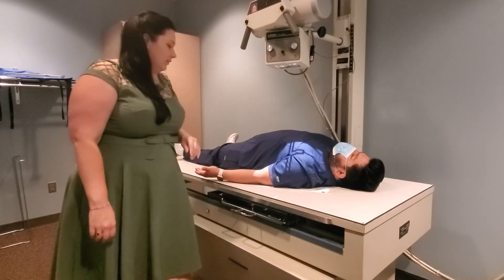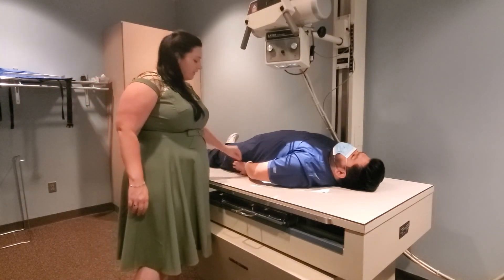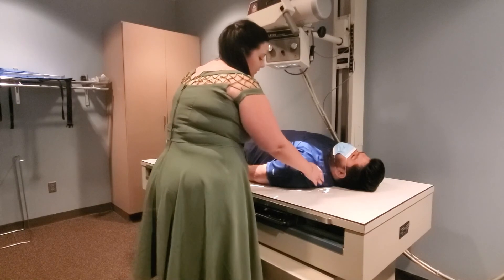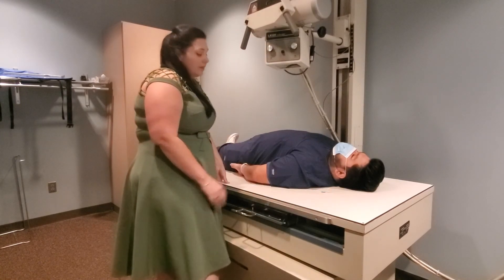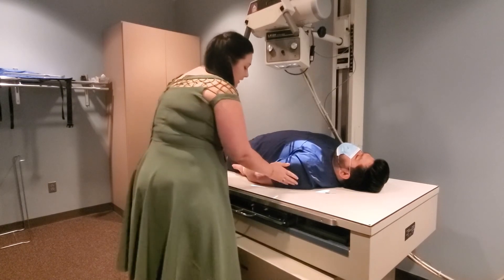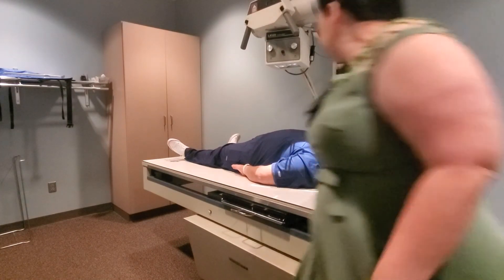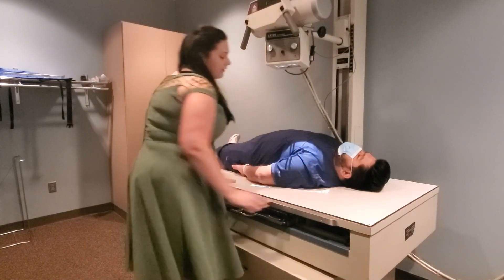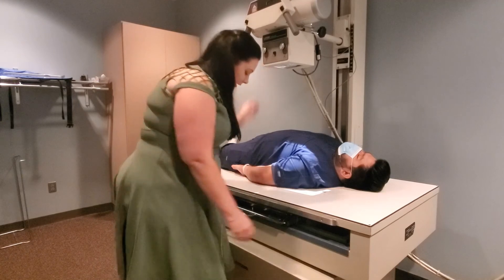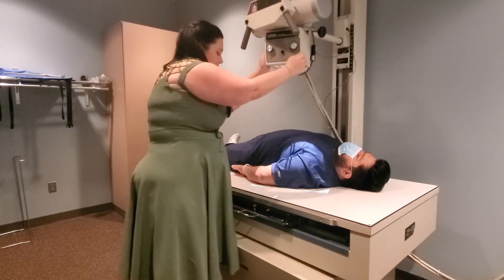For the recumbent lateral, it's even easier to transition since the arm doesn't need to bend at all. The patient just turns their hand so the back of the hand goes on their hip. Adjust with the floating tabletop if there's any clipping at the elbow. Place your marker back in the light field. Before exposing, turn to verify alignment with the bucky and confirm centering, then take the picture.